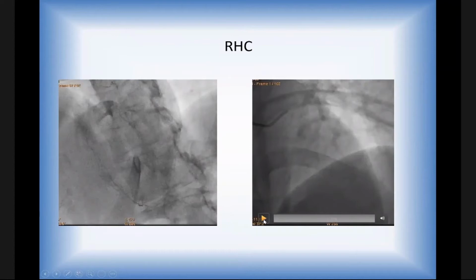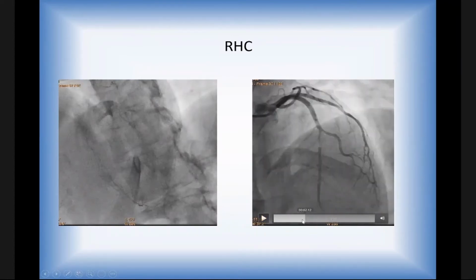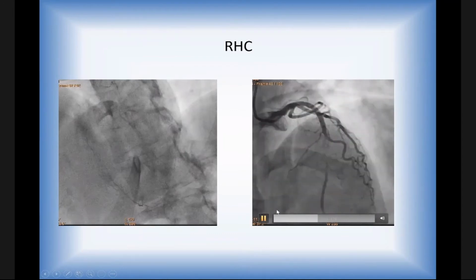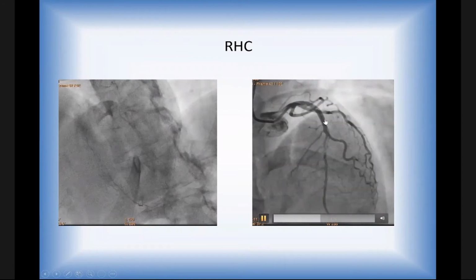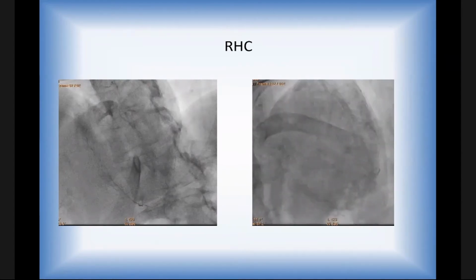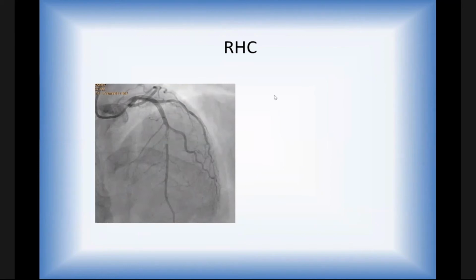This is the LAD focus here. I'm going to stop. Okay, you can see this part has a problem. It's really cut off, and then it has a reconstitution into the distal part of the LAD. So I'm going to play it again. The patient went on to do intravascular ultrasound, and they saw hematoma in the LAD. So this patient, this is the disease problem here, the mid LAD.